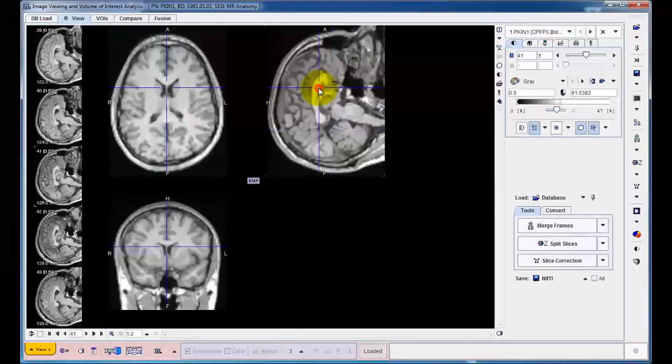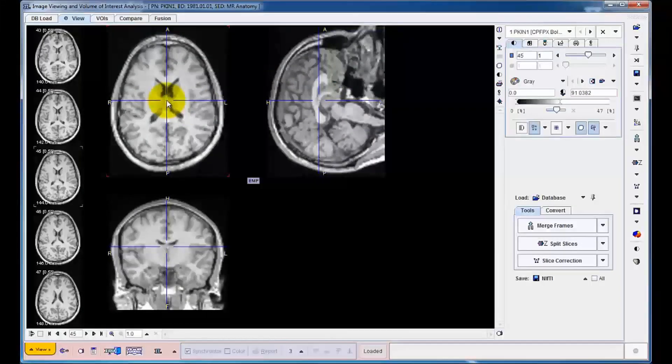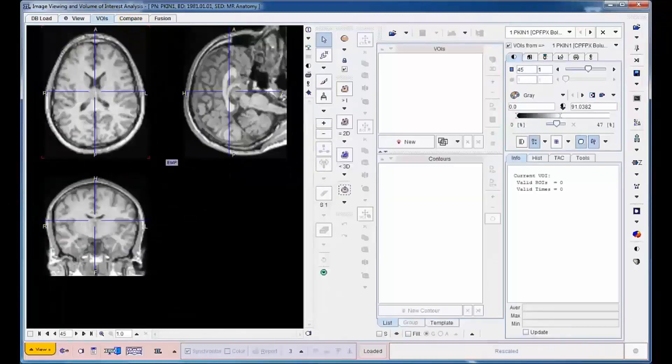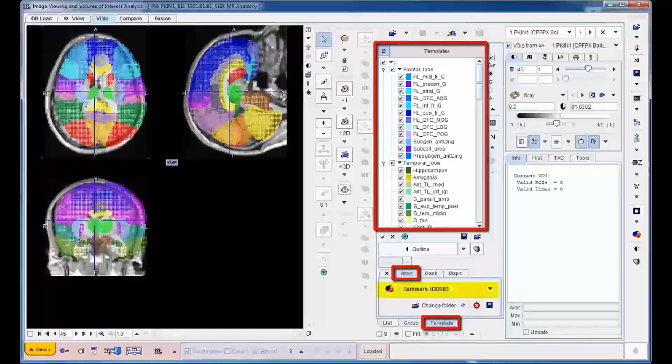The aim of the workflow is to generate outline definitions of brain areas and calculate the average PET uptake over time. VOI definition can be performed with various techniques. Here, we use the built-in template for human brain VOIs.